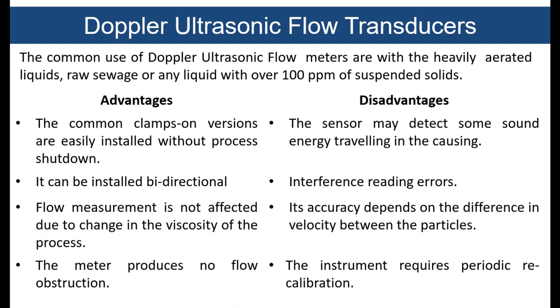The disadvantages include that the sensor may detect some sound energy traveling in the casing, and it can give you artifacts and error readings. Due to the interference reading errors, this is one of the severe disadvantages. Its accuracy depends on the difference in velocity between the particles. The instruments require periodic recalibration, that is also one of the demerits over here.